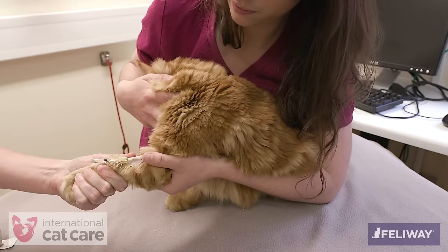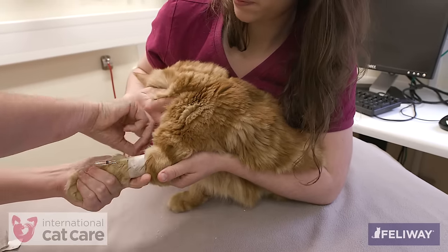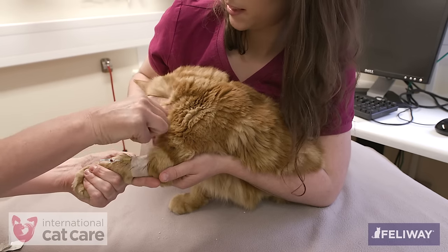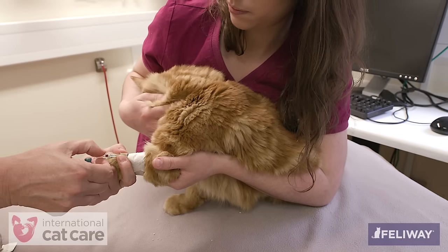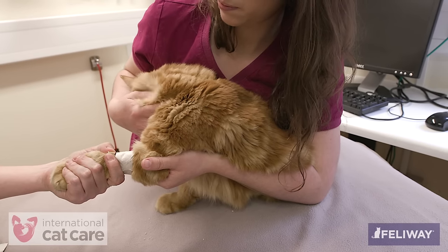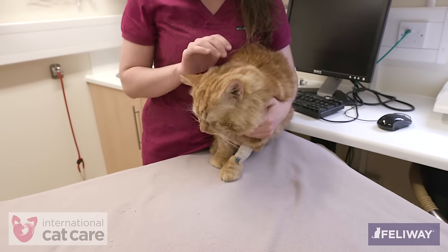Tape is used to secure the catheter, but very sticky tape should be avoided as it can be difficult and painful to remove. The cat's foot can be included in a dressing, but cats generally tolerate a catheter much better if the foot is left uncovered. The cat should be stroked or given a food reward after the catheter is placed.